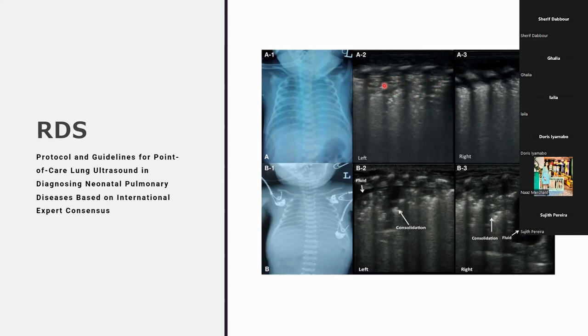And basically, this is a large area of diffuse atelectasis. It's not a focal consolidation. But can you see how this is not picked up on the chest X-ray at all? And this is classically what is called occult atelectasis. It often exists with consolidations. So the deeper areas of the lungs with the subpleural consolidations, you have.